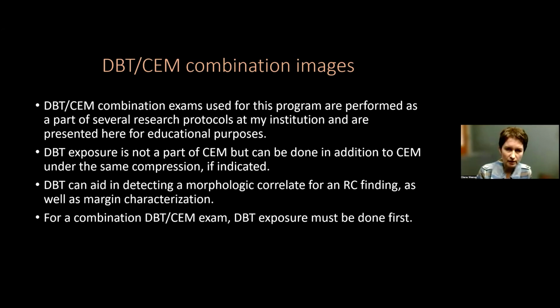And by putting them together here, I thought that could help you compare, correlate, and see if you find that DBT might play a role in your practice alongside the contrast enhanced mammography and how those findings correlate. And again, remember that contrast mammography on its own is a 2D exam, but there is a possibility to do DBT and contrast mammography under the same compression. But whenever you decide to do that, you would have to do DBT first. Of course, remember that it does add some radiation dose.